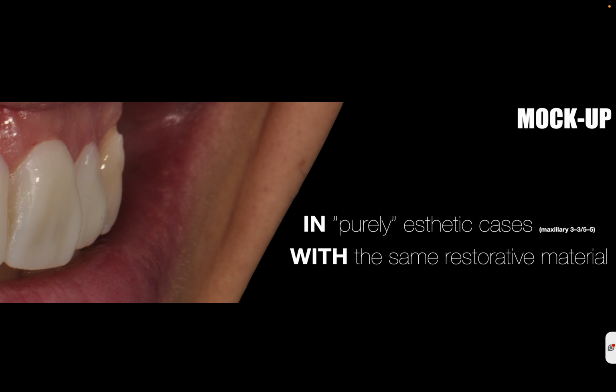Anyways, the mock-up that is obtained from the wax up that we did in the computer, I always try to do it, especially in purely aesthetic cases. And I try to do it with the same restorative material. Why? Because I want to inject flowable composite, so I want to prepare and do this in the flowable material that I'm going to use, to check the color, to check everything.